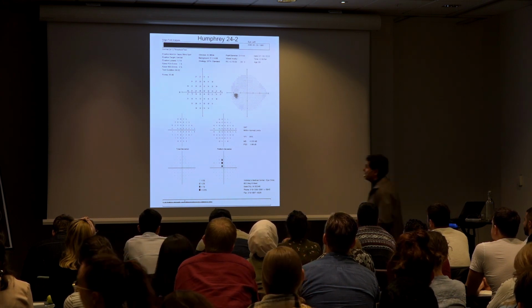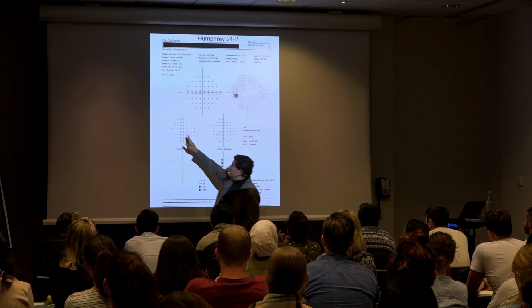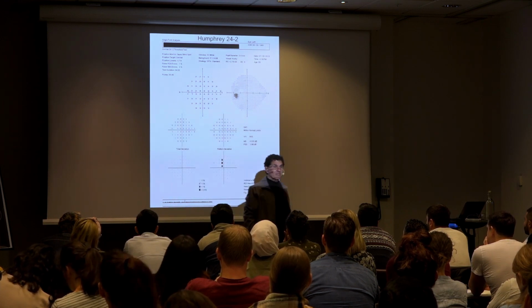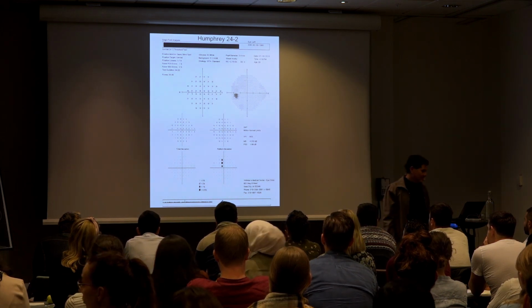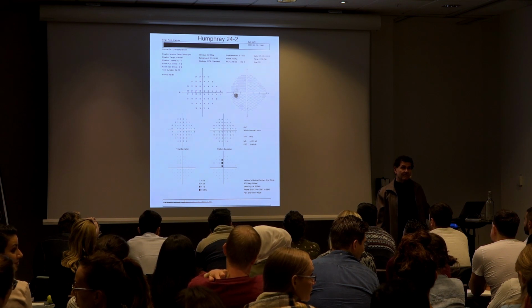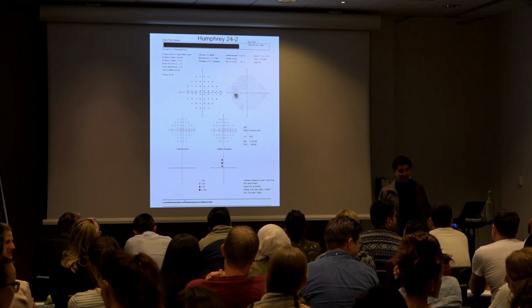So remember that this is a probability, and if you look at the actual numbers, they're down in that area, but maybe it didn't reach statistical significance. Now you start looking at all the ones that were less than normal in that area. So the harder you look, the more you start noticing these little subtle things. So I think without an OCT, I wouldn't have done a scan or anything. It's really interesting that you see a problem in OCT, but not in the visual field. Yeah, you do see it, but it's subtle.